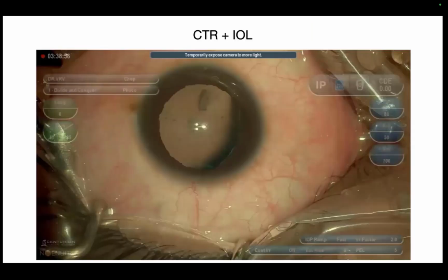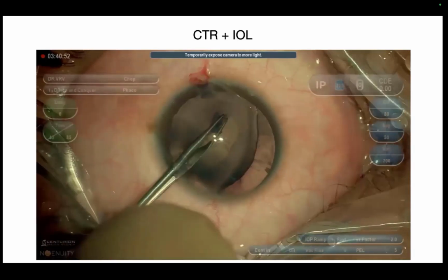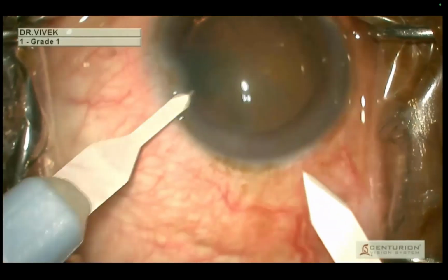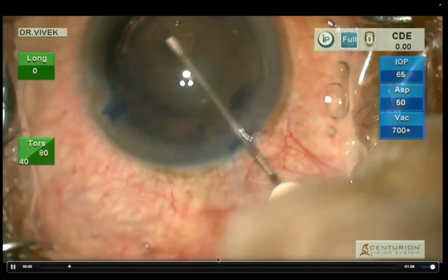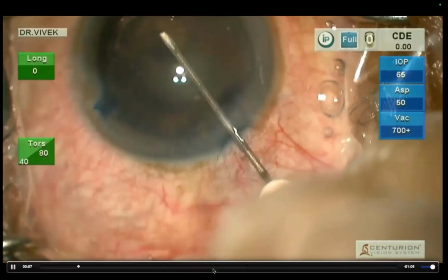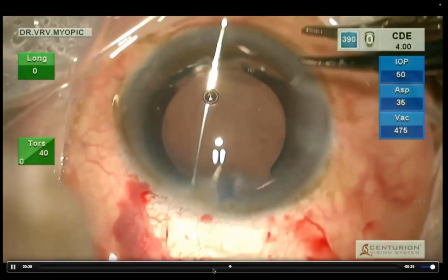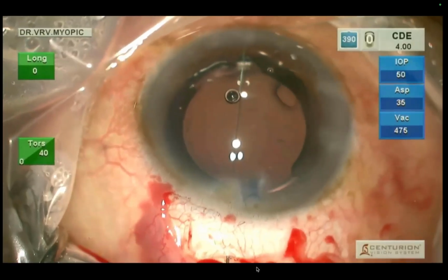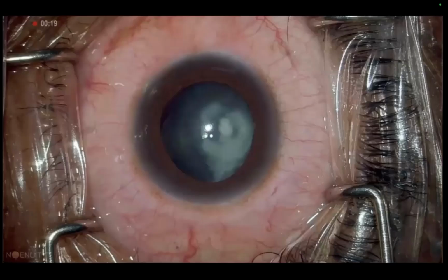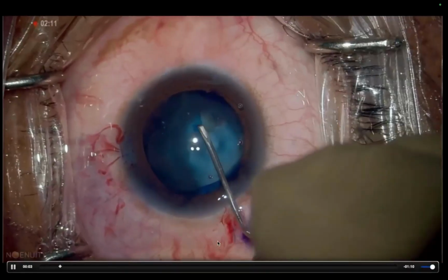So moving on to zonular dialysis management, normally we do a CTR to manage small zonular dialysis. When it's a larger zonular dialysis, we need to do a capsular tension segment. So the capsular tension segment, as you know, is a very difficult procedure, as it involves 2 sclerotomies. You have to make a Hoffman's pocket or a flap, and you have to make sure you don't puncture the capsule twice. So with our needle and suture technique, it is a little bit easier. It is just one sclerotomy.